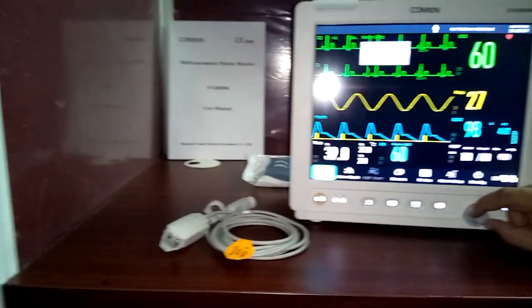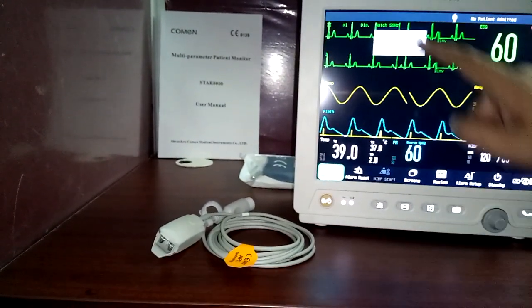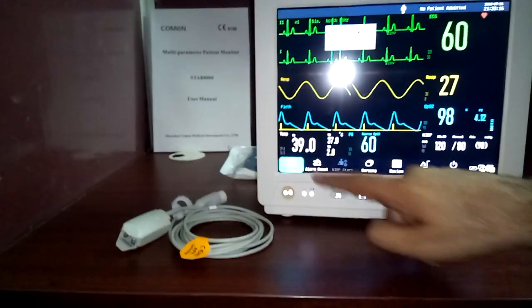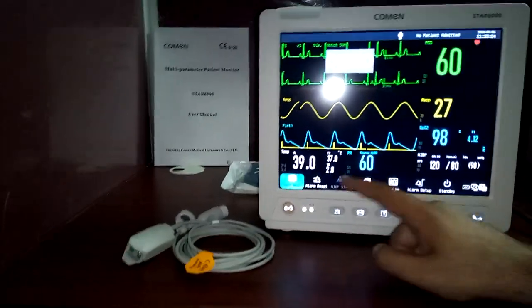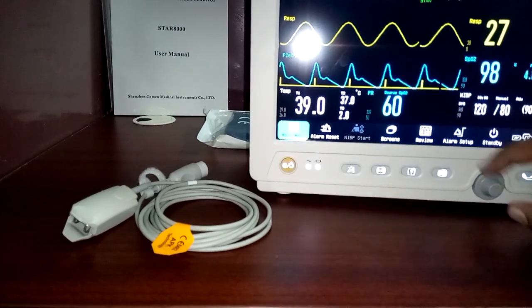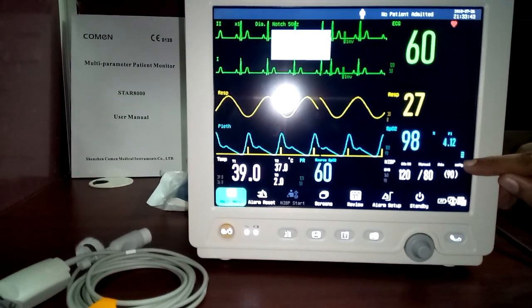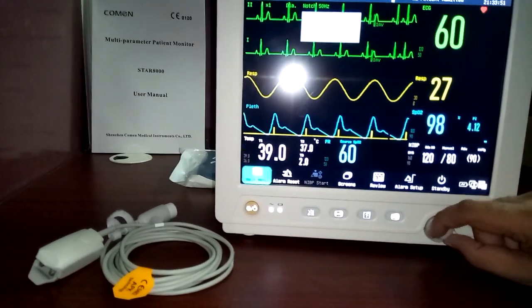Now let's look at the user interface. At the bottom there is a menu, the middle area is the waveform section, and the right side is the numerical area. You can see two ECG waveforms, one respiration waveform, one plethysmograph waveform, temperature, and SpO2. The SpO2 shows pulse rate, saturation, perfusion index (PI), and a signal strength bar. The NIBP reading and mean pressure are also displayed.